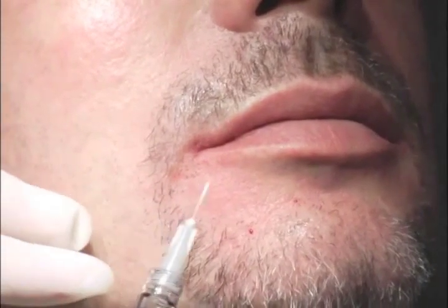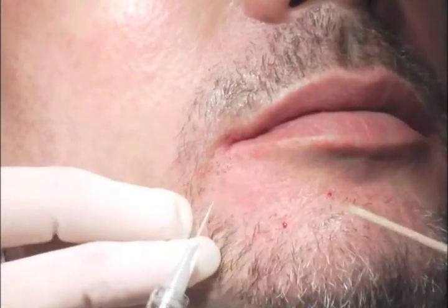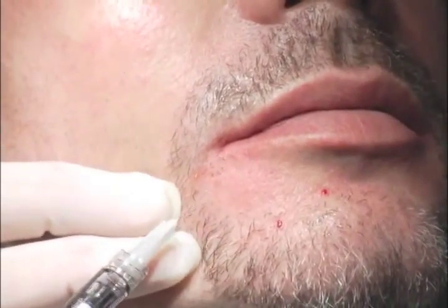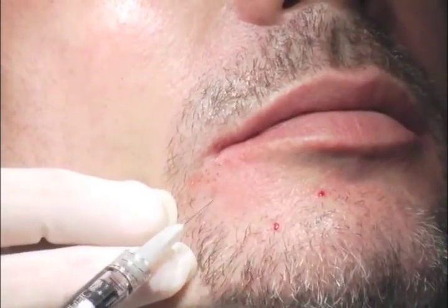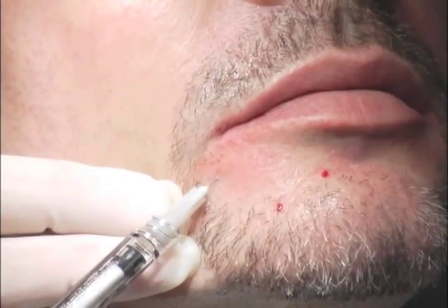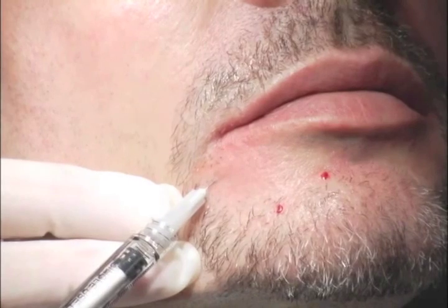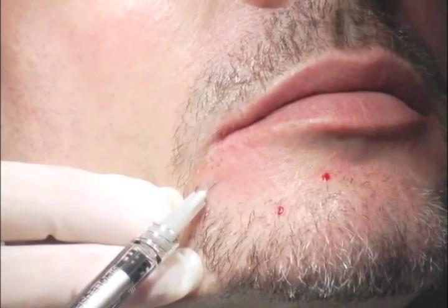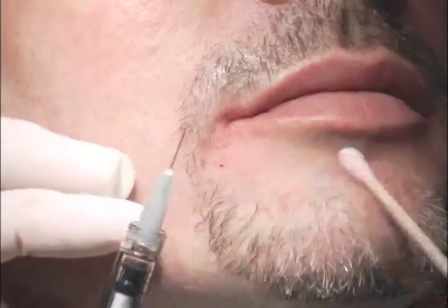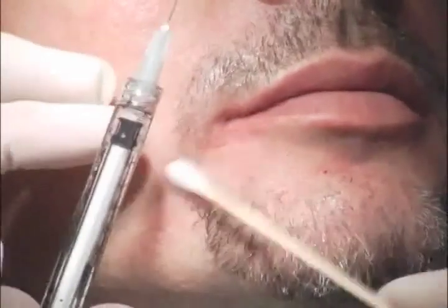Now, what we want to do now is build a little bit of this flying buttress over here. So we want to put a little bit over here. And we want to do it not from all the way down here, but we're going to build a flying buttress from right over here. And that will give them, again, the support. And let me see this right over here. And we really don't have to come all the way down this.